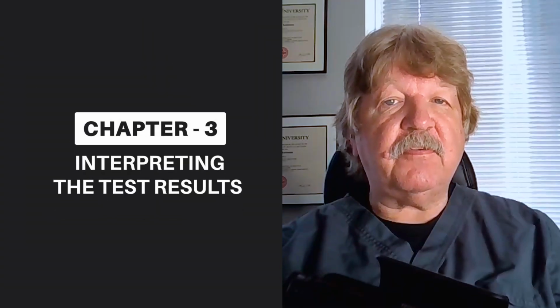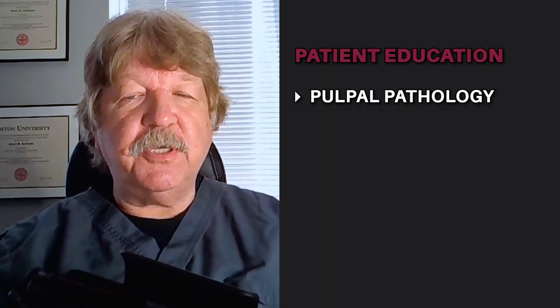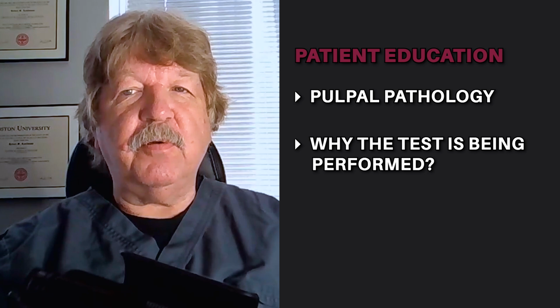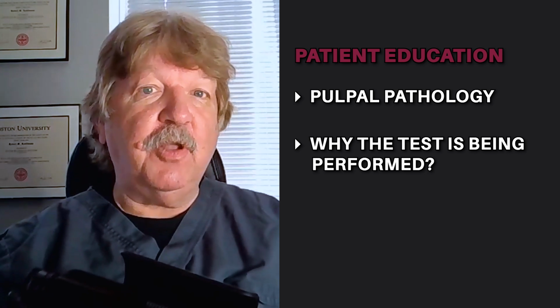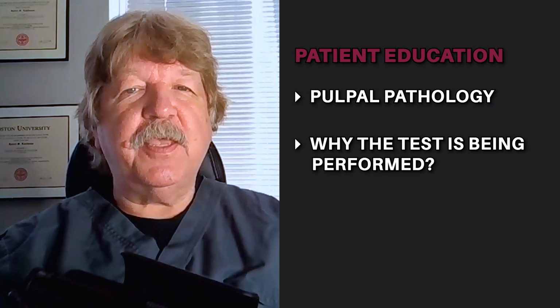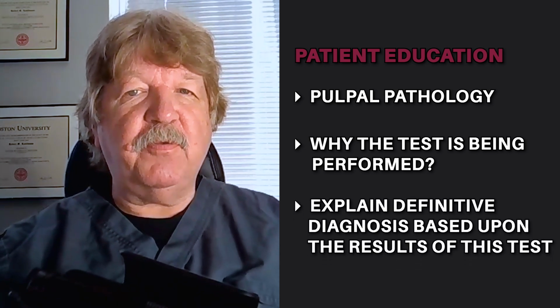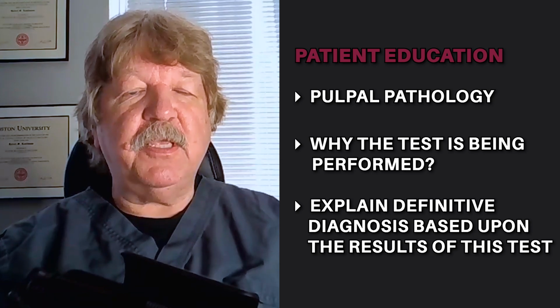When performing this test, it's very important to educate the patient about pulpal pathology and why the test is being performed. Obviously, patients will have a lot of trepidation about having a dentist drill into their tooth with no anesthetic. However, if you explain to them that the definitive diagnosis is based upon the results of this test, it helps to relieve their anxiety. A rubber dam is placed on the tooth.